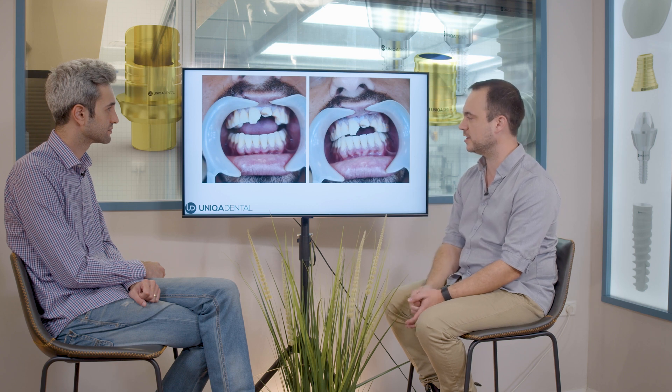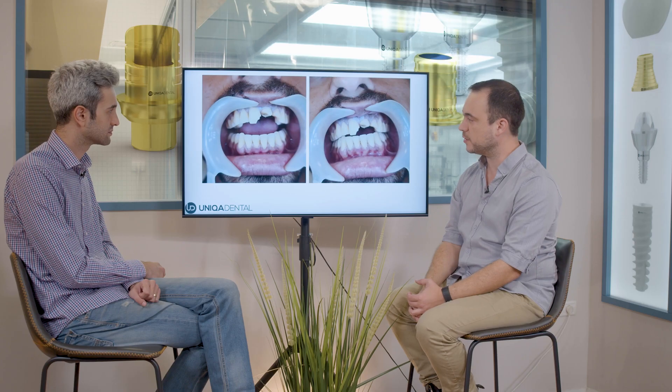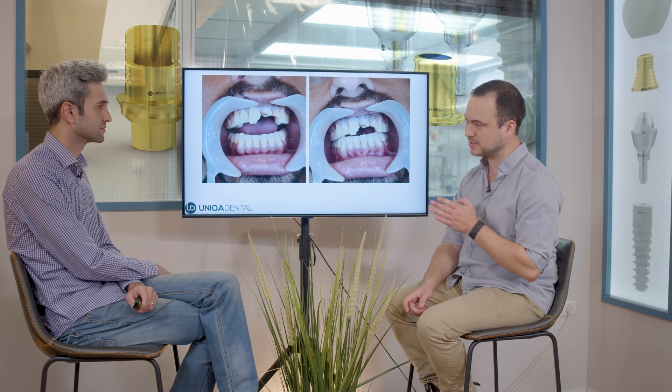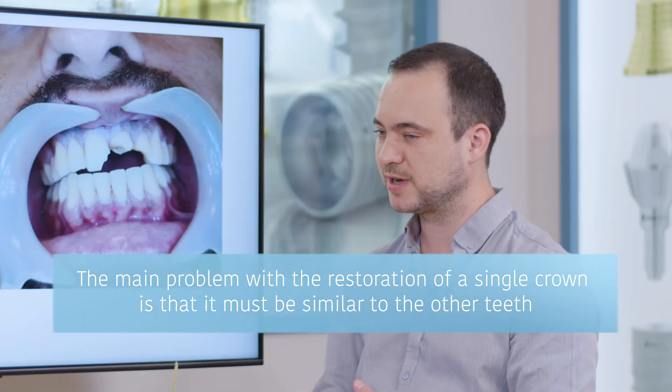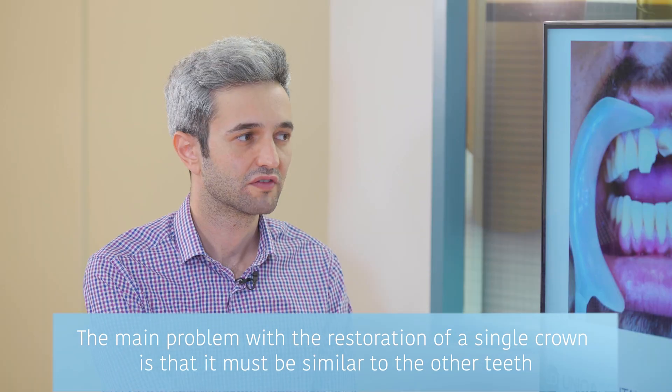Here you can see a patient who fell on his teeth and broke a couple of teeth. Probably these two teeth need root canal treatment and a crown. This one you can restore with composite material. The problem with esthetical cases is when you need to make only one crown — that crown has to be similar to the other teeth, and it's very hard to color it to look exactly the same. If it's only one.